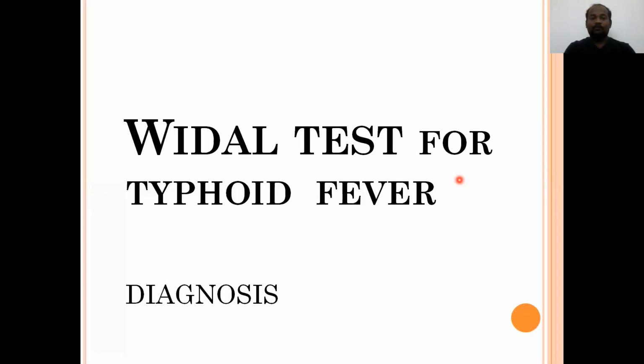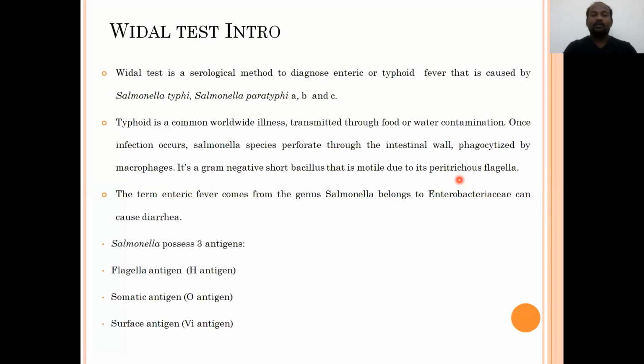Widal test for the diagnosis of typhoid fever. Widal test is a serological method to diagnose enteric or typhoid fever that is caused by Salmonella typhi and Salmonella paratyphi A, B, and C strains.